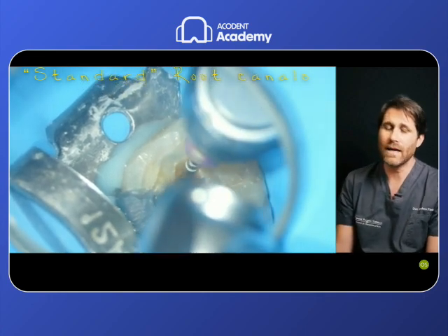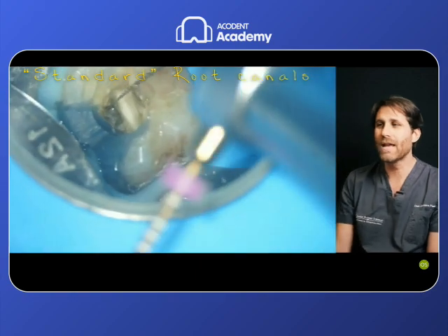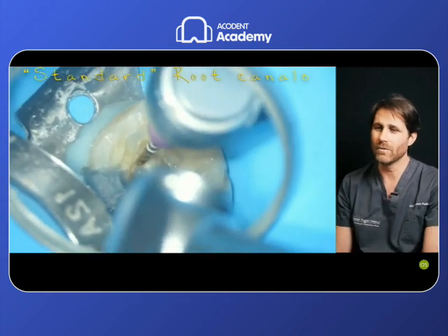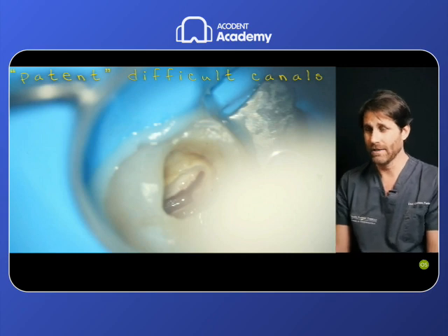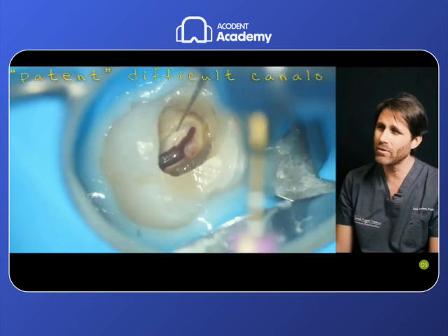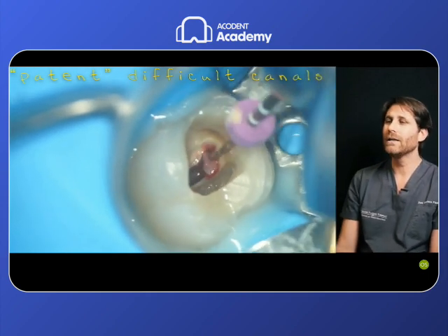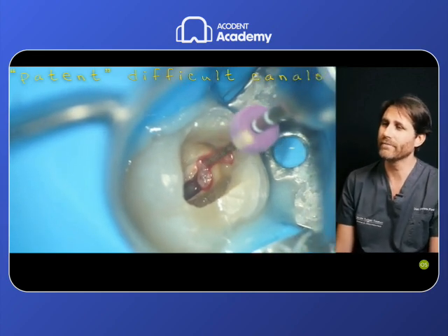That does not need very many properties for scouting these root canals, but can be scouted with a very flexible, effective, and efficient instrument like this one, or in patent but very difficult root canals. Difficult root canals, but that must be patent. That means, for example, an MB2 root canal. Those are the MB1 root canal treated with the Way1 Gold Glider.